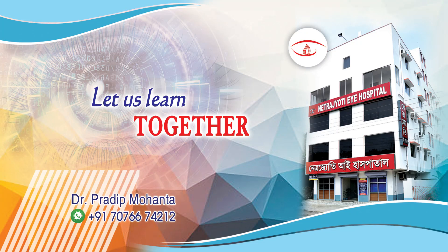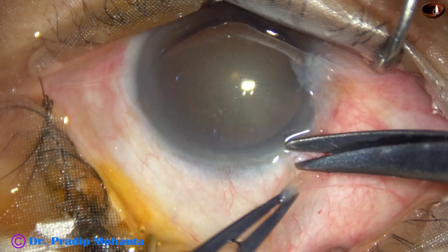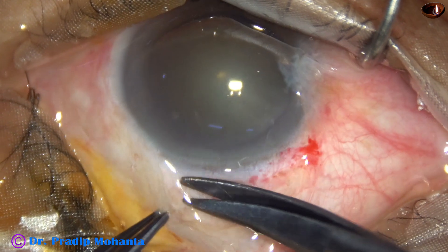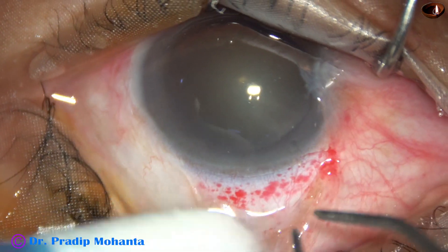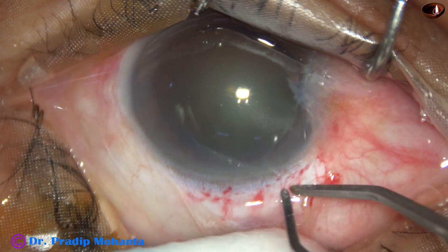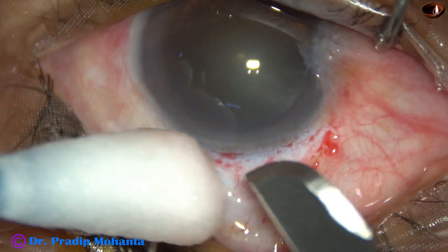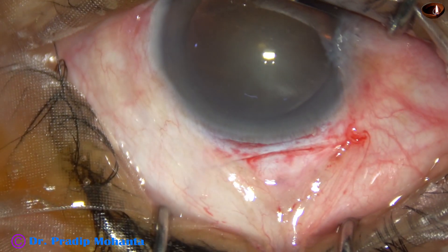In this video we are going to see a pre-chopper assisted SICS. This is a peritomy from about 11 o'clock to 1 o'clock, and now very mild cautery is done. It should not cause shrinkage of tissue by the cautery.